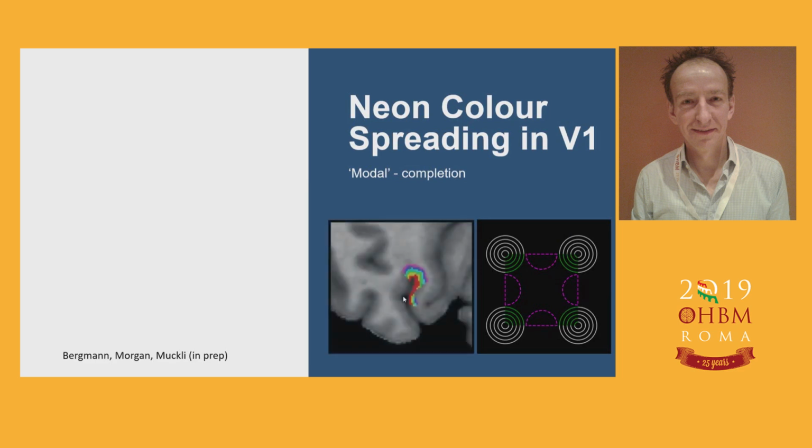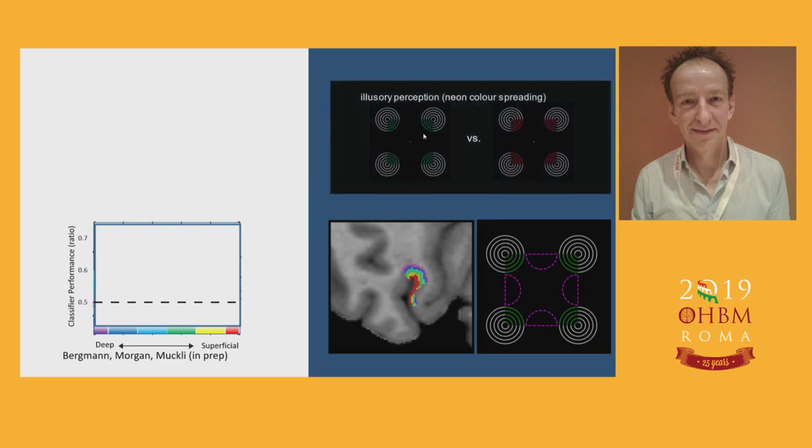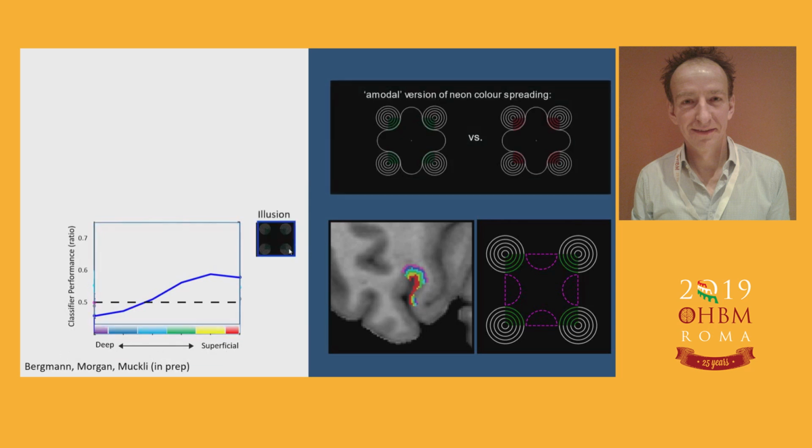So to map out, we have this illusion. Those are our regions of interest. That's where we want to see the signal. We mapped out again in V1 those areas in 16 subjects. And now we do MVPA analysis again. We train on three runs to predict the fourth run, and the performance is shown here. The task is for the classifier to predict which color of the illusion was present, green or red. And you can see that only in the superficial layers, this prediction is above threshold. So illusion, again, like in our previous study where it was more like filling in of a scene, you can pick it up in the superficial layers.